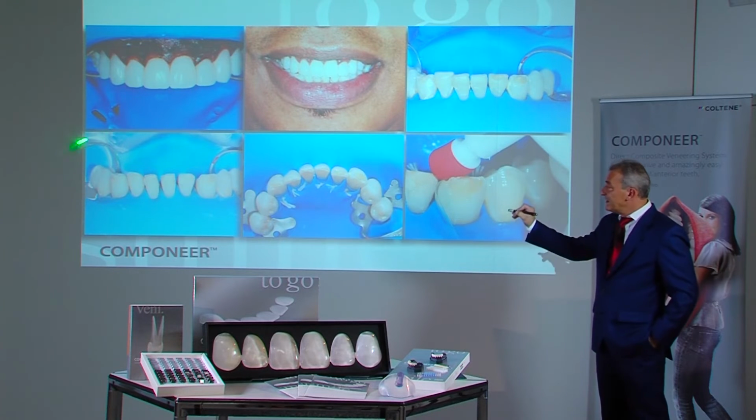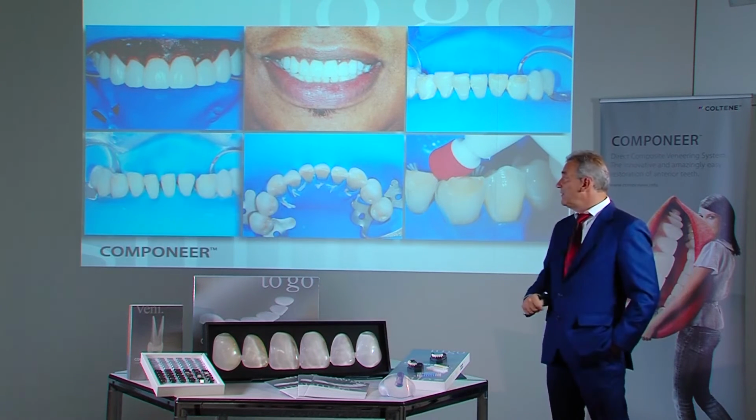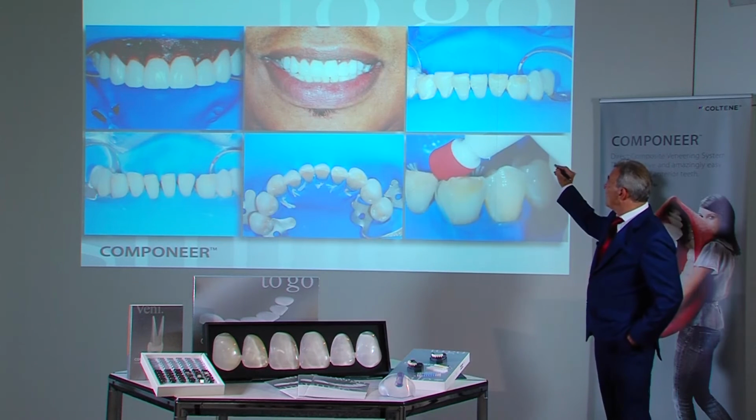Then it was decided to optimize the mandible, as hypoplasias and gaps were also present there, and not all the teeth were quite in the correct position.